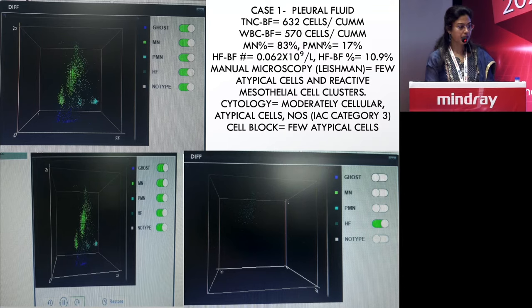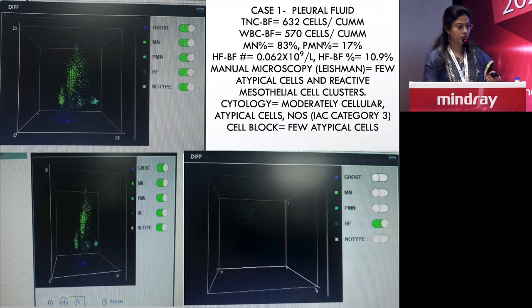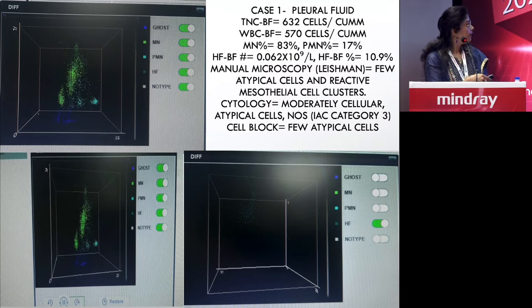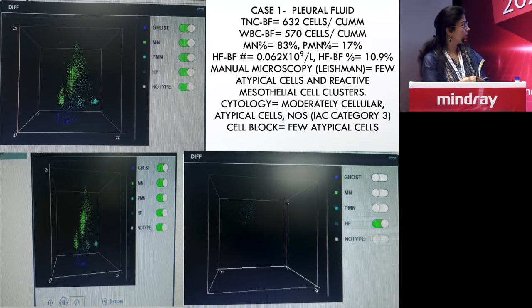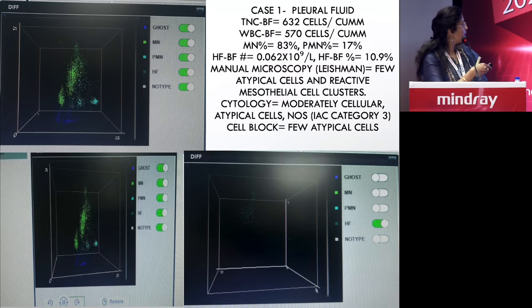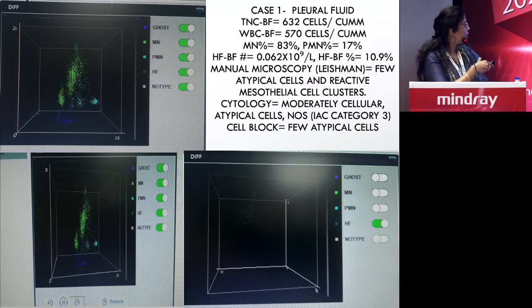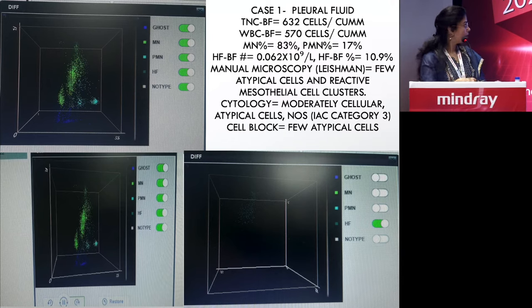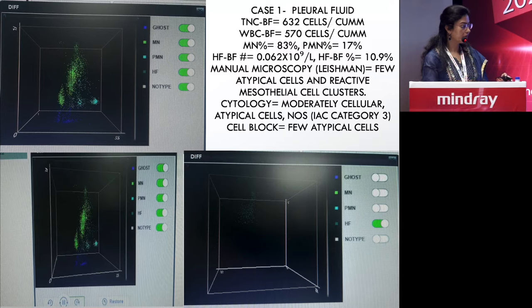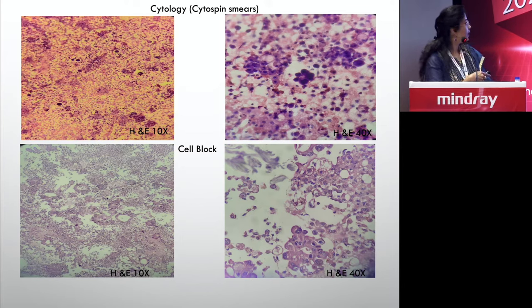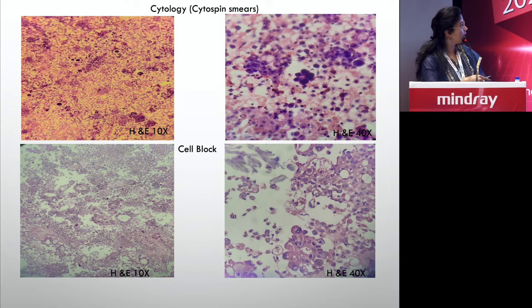On the analyzer, the total nucleated cells, WBC cells, and the high fluorescence body fluid component showed around 62 cells. On manual microscopy, few atypical cells interspersed with reactive mesothelial cell clusters were noted. Cytology was moderately cellular and was categorized as category 3 — atypical cells. On the analyzer scatter plot, there is an area where there is a mixture of high fluorescent cells and mononuclear/polymorphonuclear cells. When masking those cells, 62% of the cells fell in that bracket. The cytosmear showed a very cellular smear with many reactive and mesothelial cells and some atypical cells.